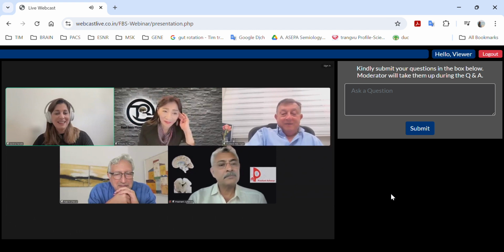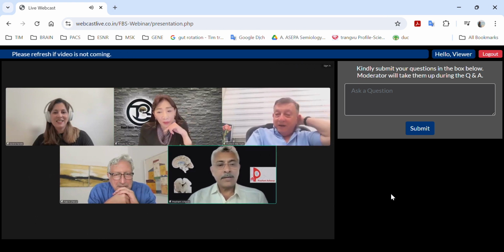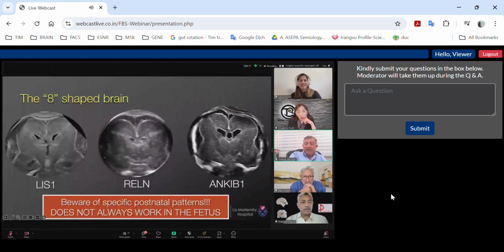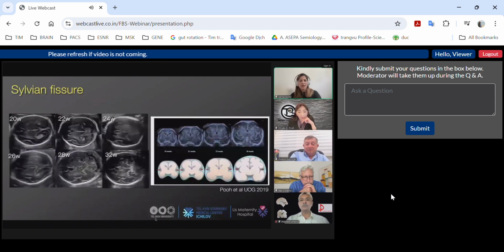Okay, this is good. In fact, I had the number 8 printed on, and I have erased it. Now I understood that didactically it was wrong. Many of the participants should not say figure 8, but toast-shaped brain. This is Daniela's. Yes, okay, this is the 8. Do you see the slide? Okay, so normally I will do something else. I will go back to Ritsuko's here.